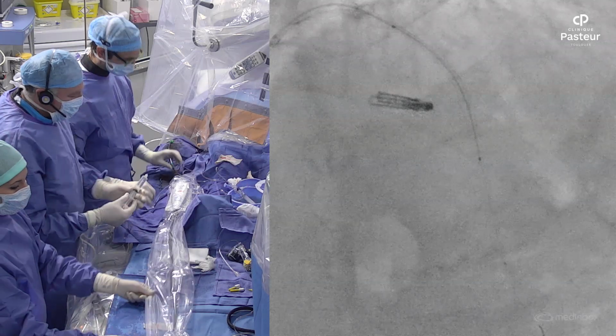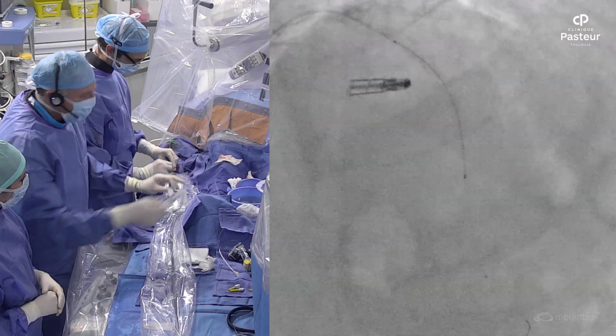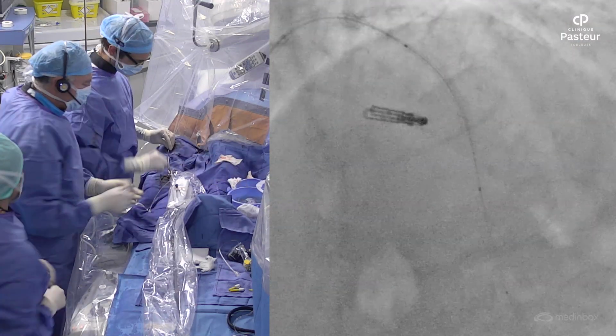So now it's a tough job. We don't have the injector, so I have to inject the dye. That will be tough for me.